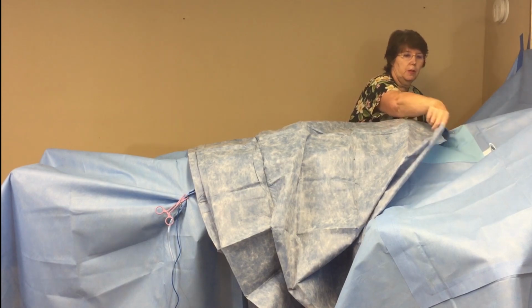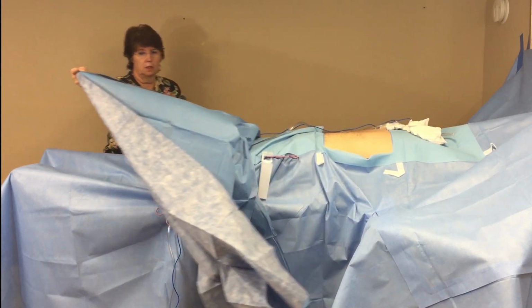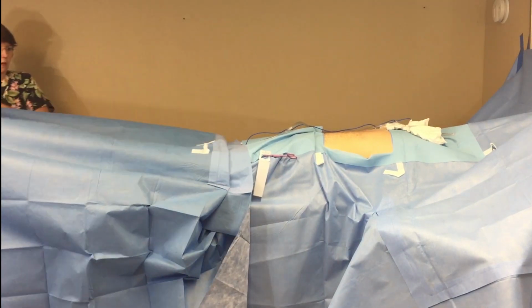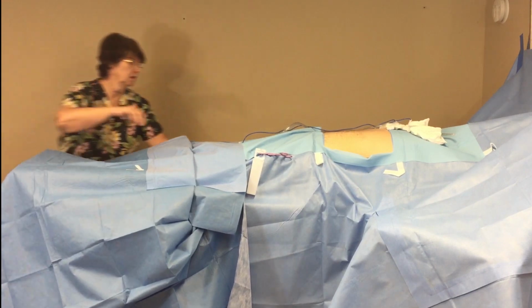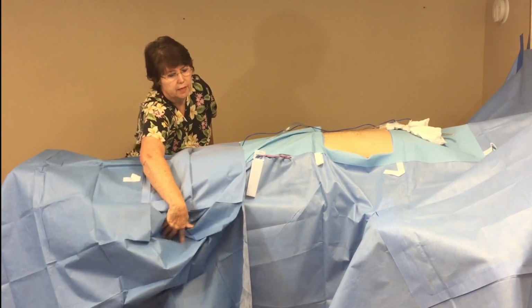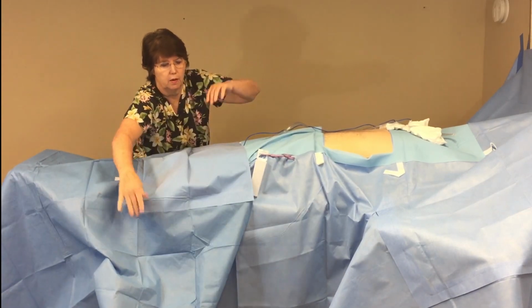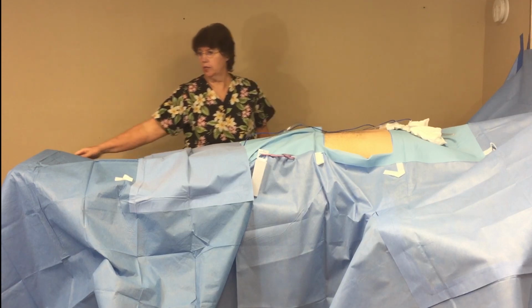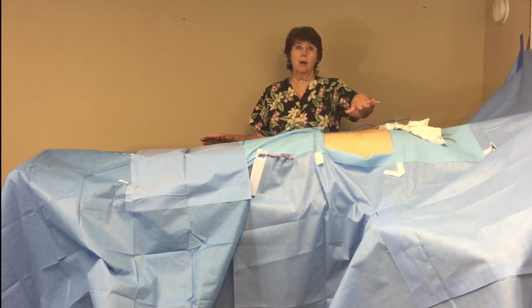So you take the drape on either side and bring it down, and over the feet. And hopefully that's down that side like it would be if you had someone on that side draping it. And as you can see, we have preserved the sterile field and protected the operative site.